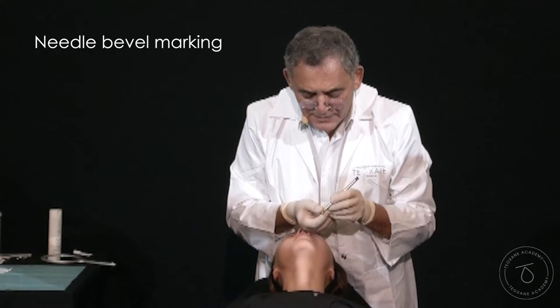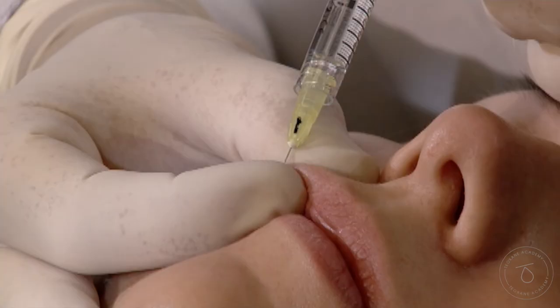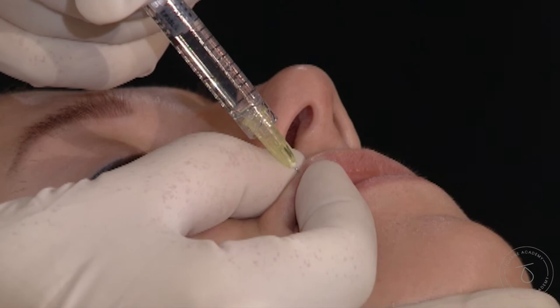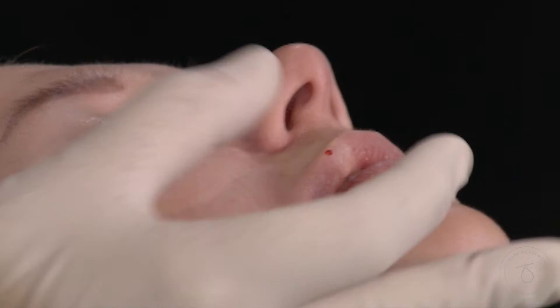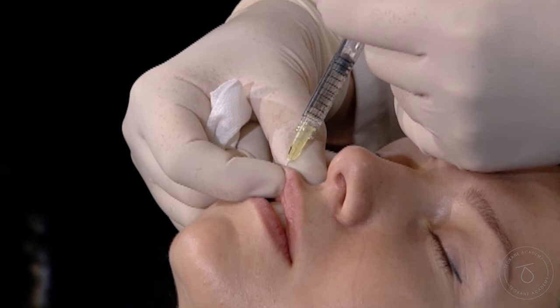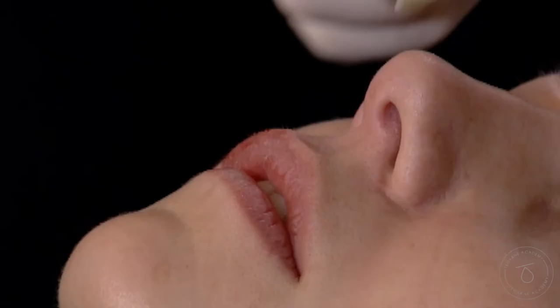I know exactly where the filler is going out — I can be extremely precise. I pinch my lip and I'm going to try to find this virtual canal, that you can easily find. My needle is 4mm, maybe 2mm deep. And I can really mold. If I have too much hyaluronic acid, I can take it out, because I put the marks exactly where the filler will come out. You see the whitening going along the rim? That's perfect. I pinch, always, very gentle, very delicate. I just control the outline at the moment.